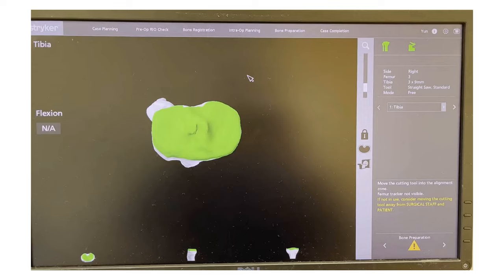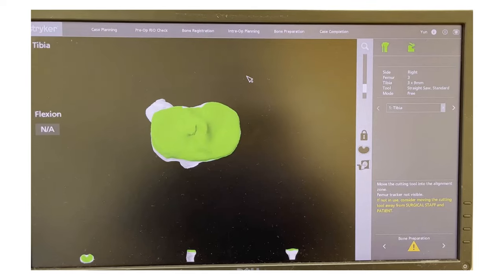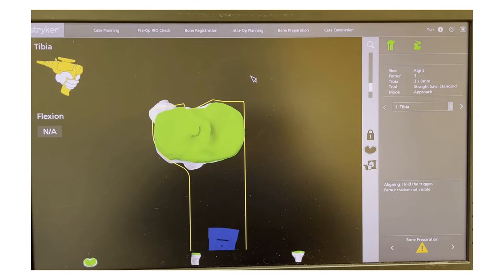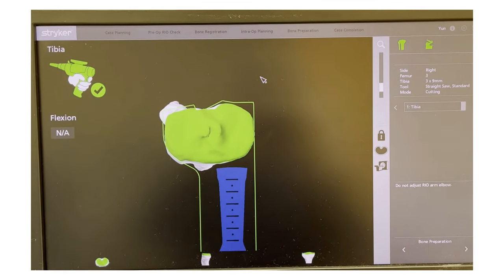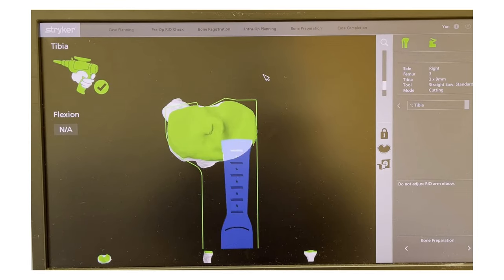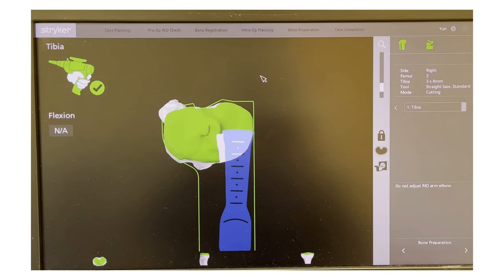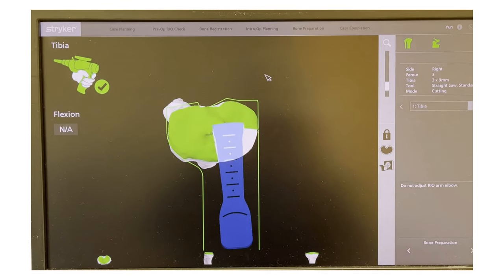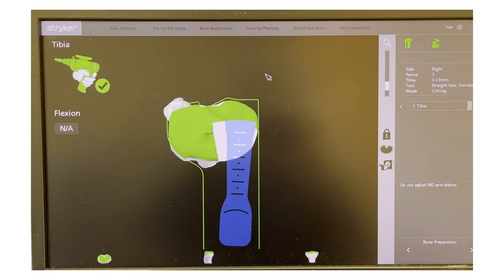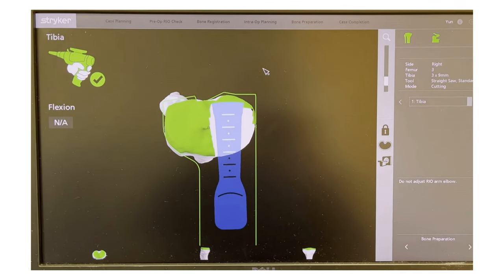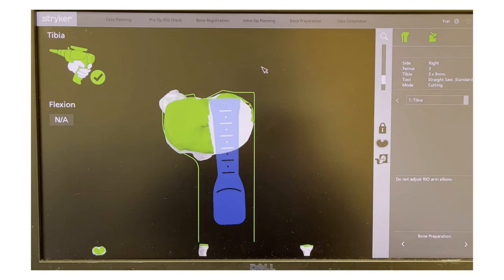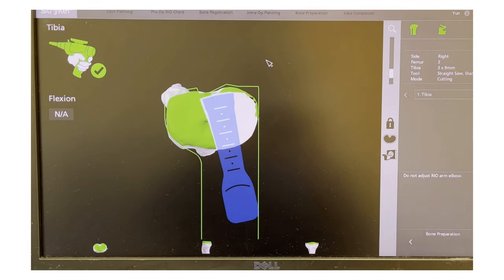On this video, we've established virtual boundaries around the tibia. I'll show you how that boundary keeps the saw blade within its margins at all times to make sure that we never go past and potentially injure the posterior neurovascular structures. That line acts as a guide rail or a curve beyond which the blade just cannot cut.